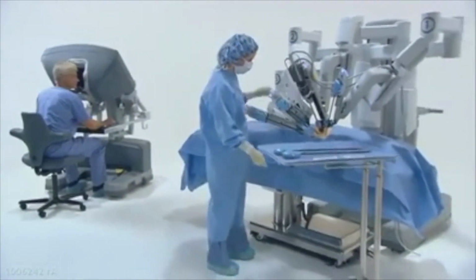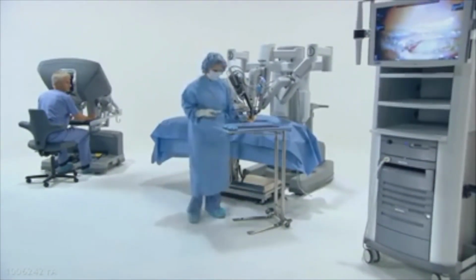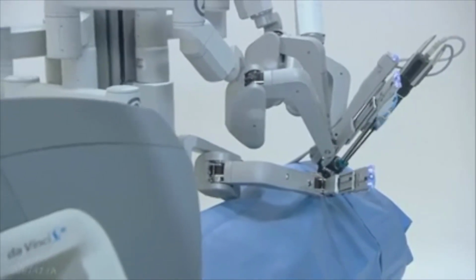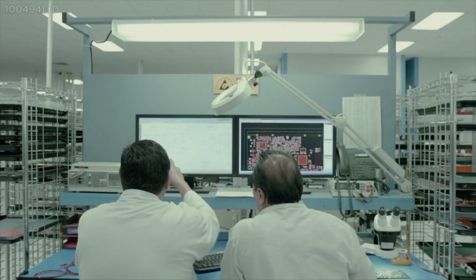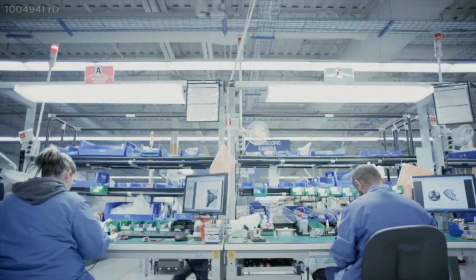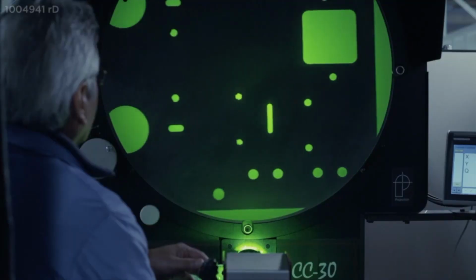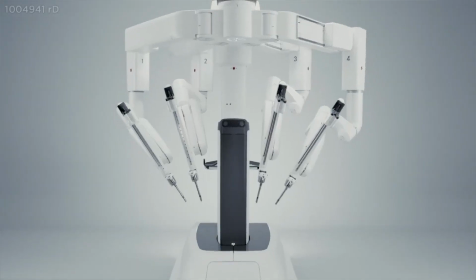Some of the new things that we're bringing into the community, including the robotic surgery platform with the Da Vinci surgical instruments. So as a urologist, I use the robot to operate on kidneys, adrenal glands, bladders, and prostates. Robotic surgery has developed over the last several decades, and it started out with one big robot, and it was initially designed by the military to be able to do surgery at the battlefield and having the surgeons away at a safe location.